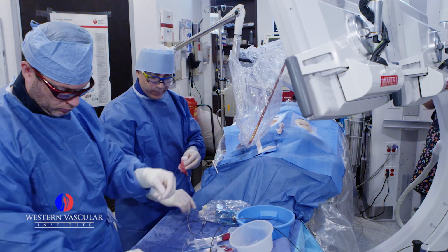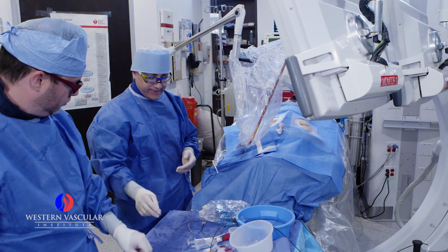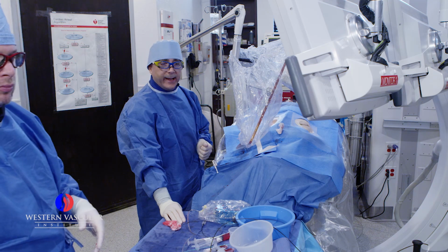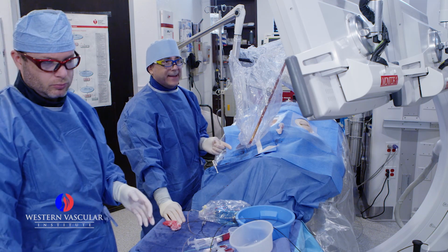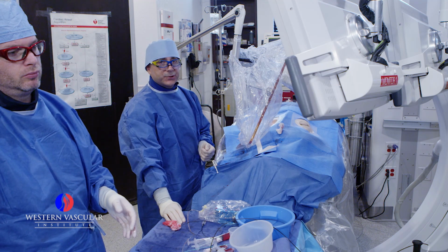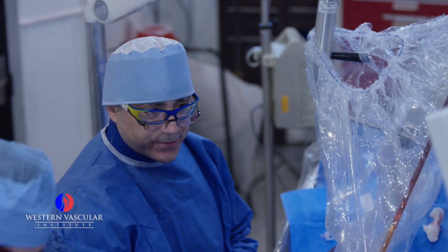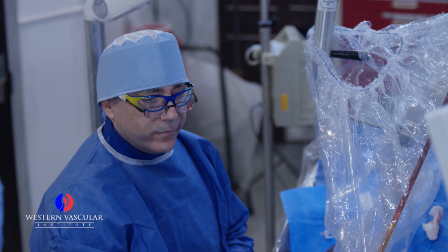It does tend to remove plaque from the wall of the artery by heating the plaque, and it causes the plaque to vaporize. And there's very low incidence of what we call embolization, which is where plaque breaks off and travels lower down in the leg and blocks off vessels, which can be a real issue. The laser is just as effective as any other atherectomy device to remove plaque.